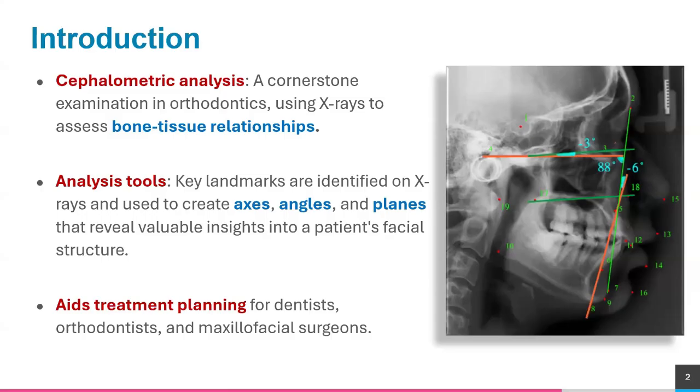To firstly introduce the topic, cephalograms are lateral X-rays of the human face used by orthodontists to perform cephalometric analysis. In this analysis, landmarks are marked on the cephalograms and vectors and angles between these landmarks are measured. Cephalometric analysis is primarily used as a treatment planning tool by the orthodontists.